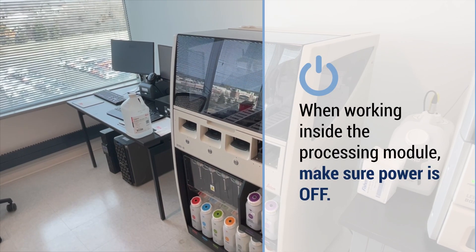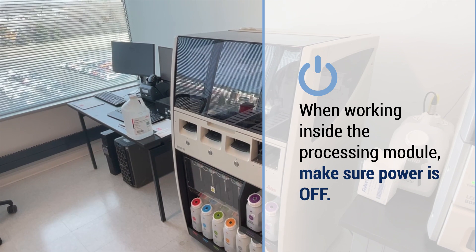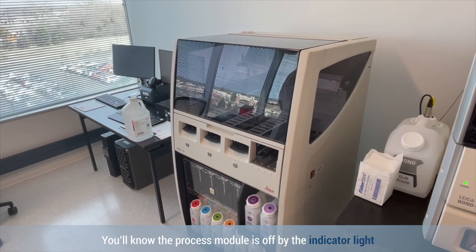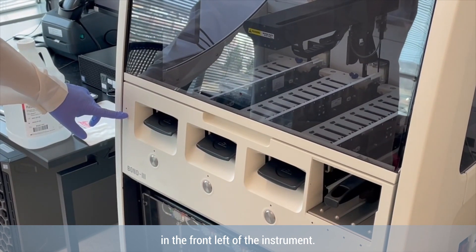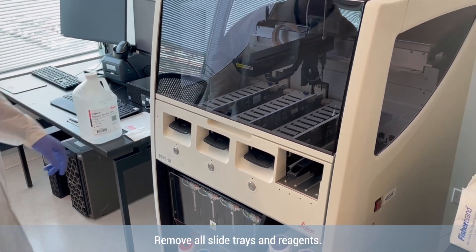When working inside the processing module, make sure the power is off. You'll know the processing module is off by the indicator light in the front left of the instrument. Remove all slide trays and reagents.